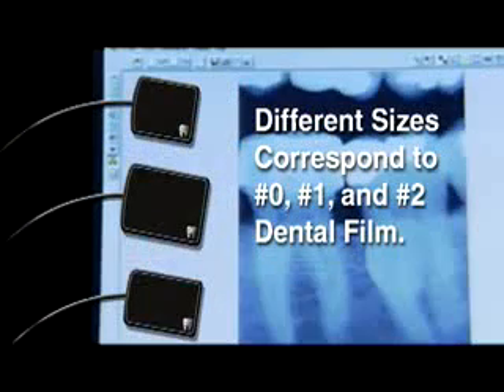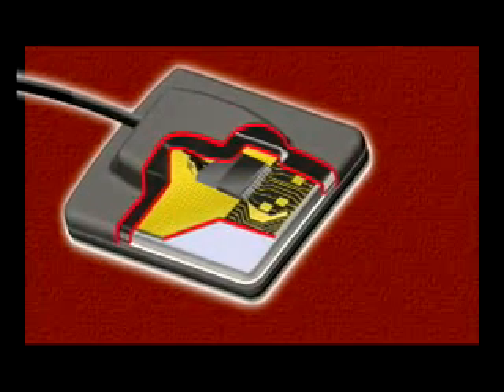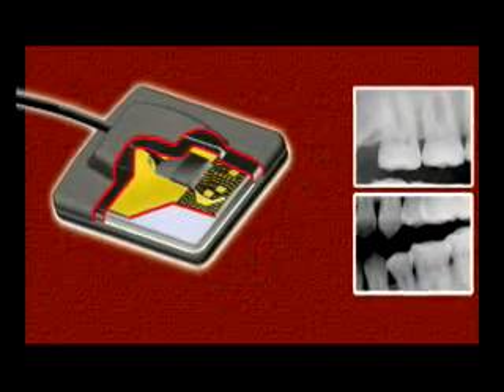Available in three convenient sizes that correspond to number zero, number one, and number two dental film, the Image Ray sensor is thin with soft rounded corners that maximize comfort and ease of use. In addition, Image Ray provides superior crystal clear image quality.